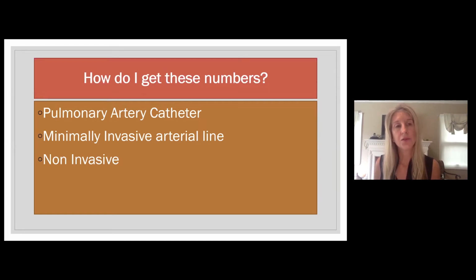And that's what I was using with patient number 1, 2, and 3. They actually had an arterial line, and I was able to use the EV1000 or the FloTrac to obtain these numbers. And lastly, there is a way, it's completely non-invasive.